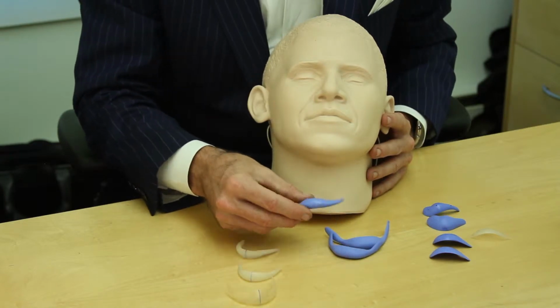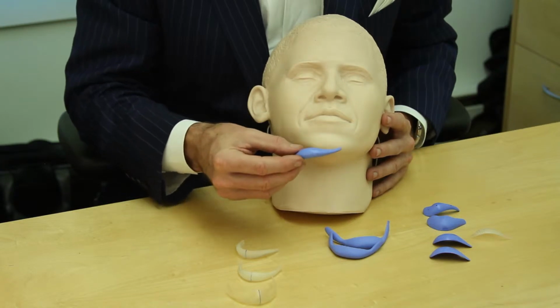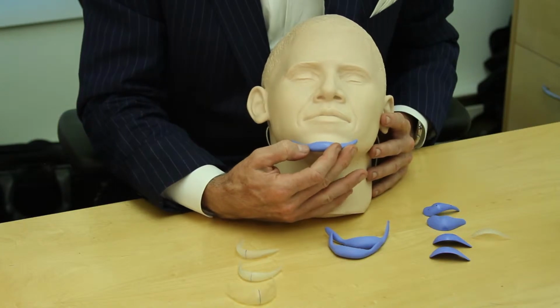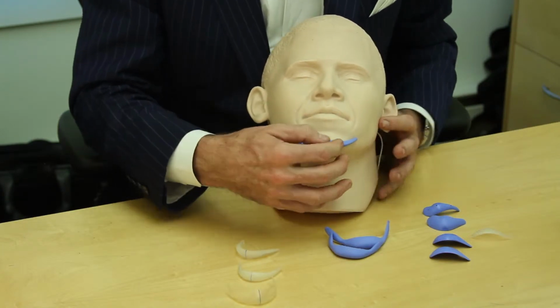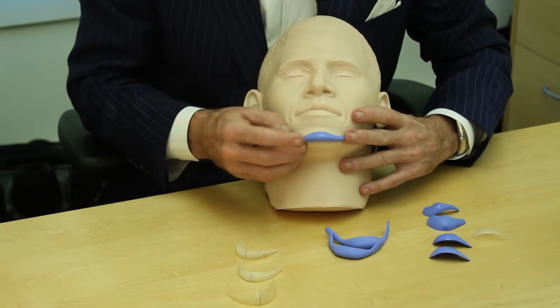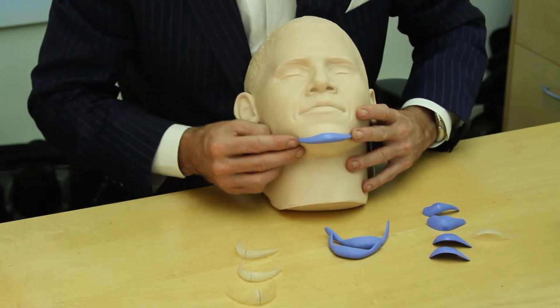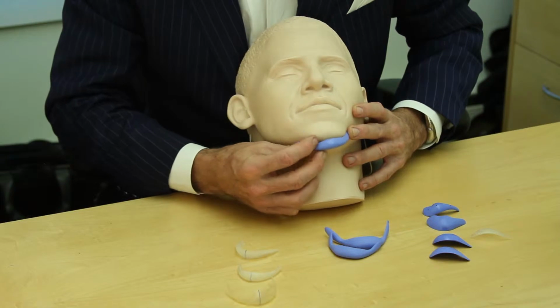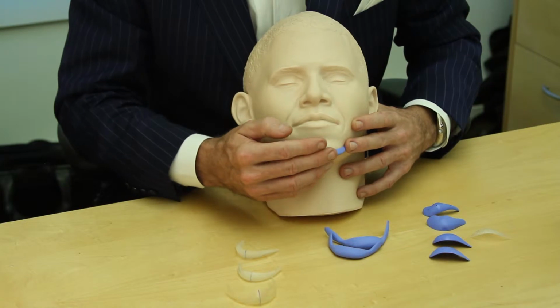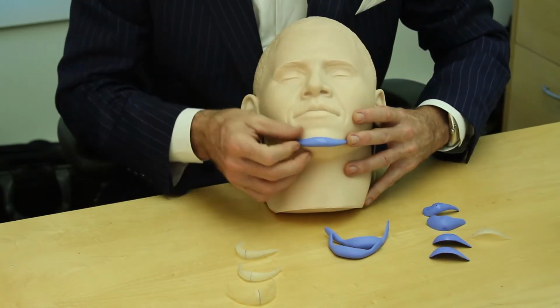Now these implants are designed in what are called anatomical configurations, and I'm showing right now a sizer. This is actually not an actual implant, but a sizer that we can put on somebody when they come in. But these implants are designed so that they contour very nicely to the underlying bone, which in the case of the chin area is the mandible bone or the chin bone, and that's extended all the way along the side. And you can see that they taper gradually over to the side to virtually no thickness or no augmentation. And in the midline, we can give a variety of thicknesses or distances out from the chin itself.